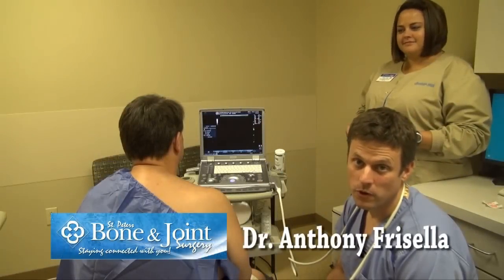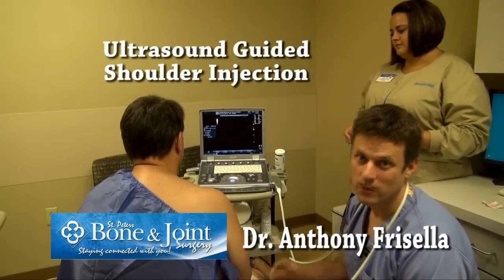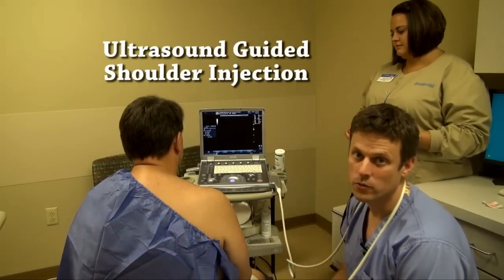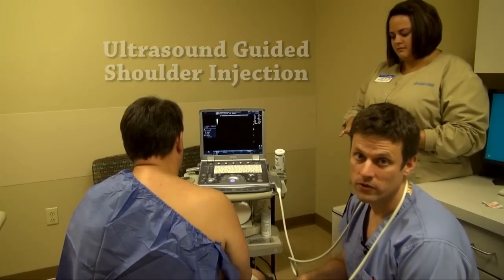Hi, I'm Dr. Anthony Frisella and we're going to be performing an ultrasound guided shoulder injection today. He has some inflammation in his shoulder. We're going to use the ultrasound machine to guide the needle into the correct position in the shoulder for the cortisone injection.